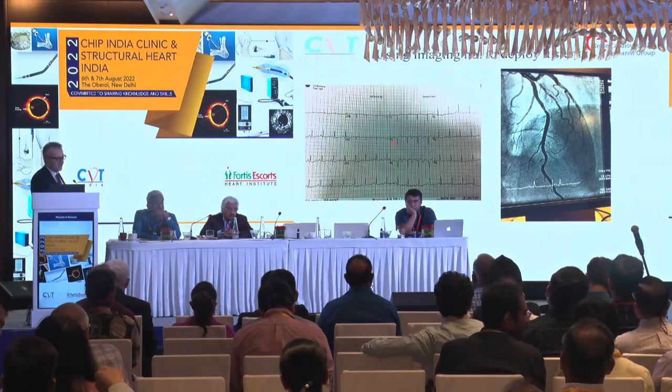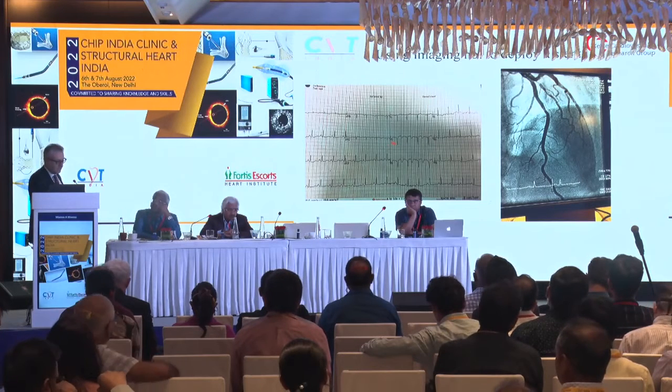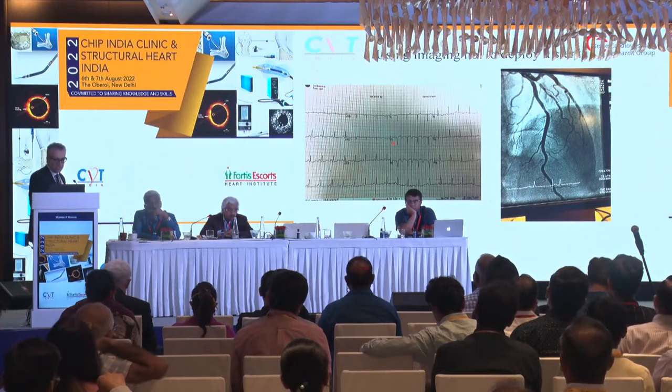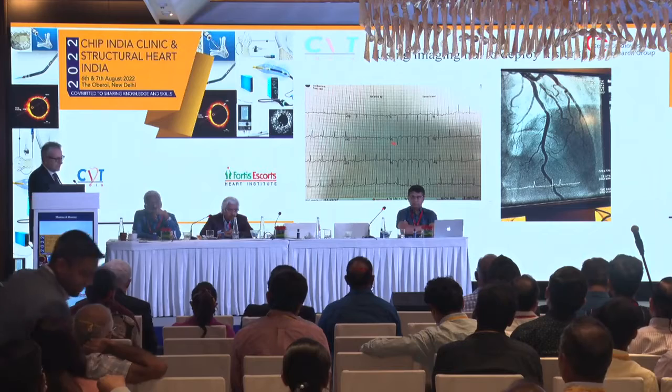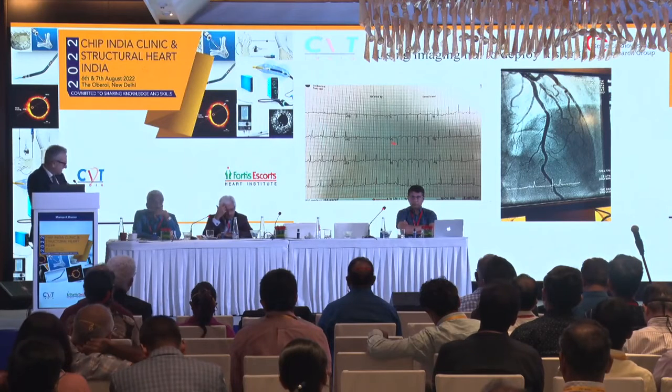This is a lady that came in with an ACS and with some anterior changes that you can see here. Now, this is an interesting case because this lady came in the day before, so she had a chest x-ray, and the chest x-ray showed a mass in her lungs. So she came in for a fine needle biopsy, CT guided. She went home that evening, developed chest pain, came in with these ECG changes.